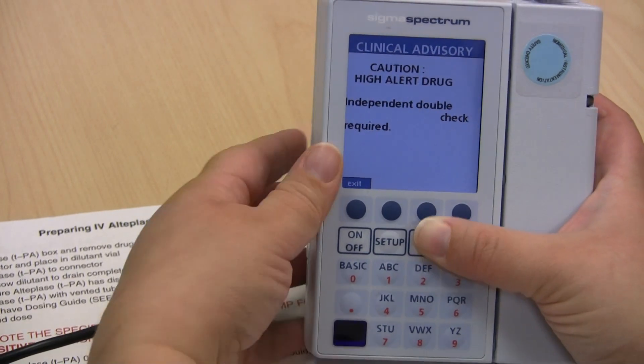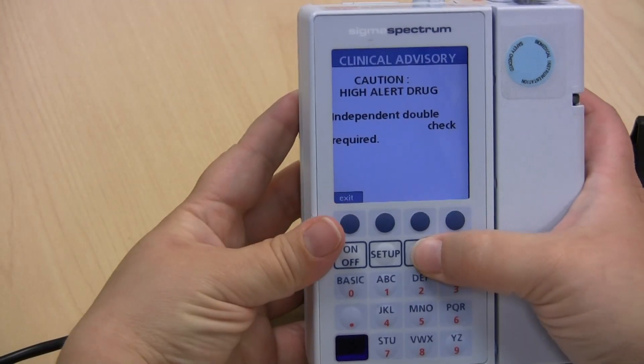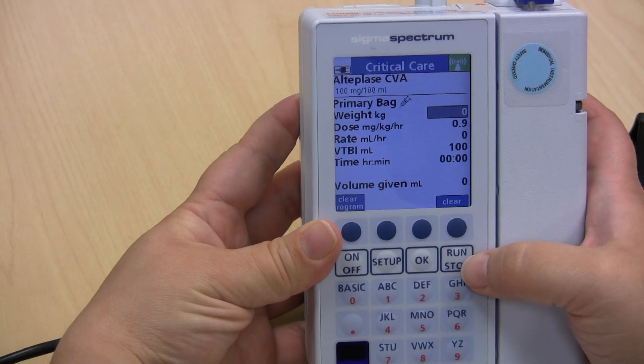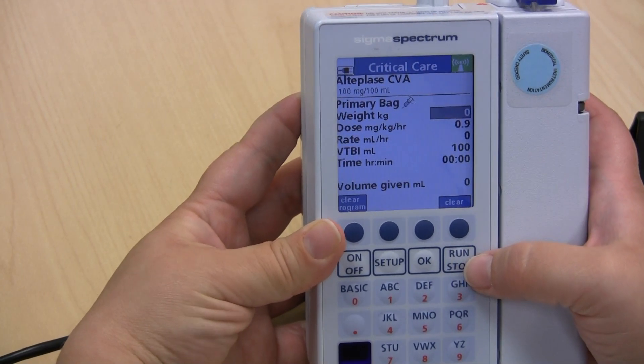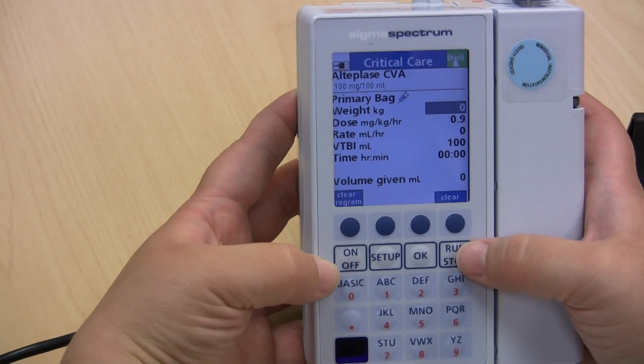Remember, this is a high alert drug so it requires an independent double check. Set up the pump to the appropriate weight of your patient. We will use 75 kilograms for this particular patient.